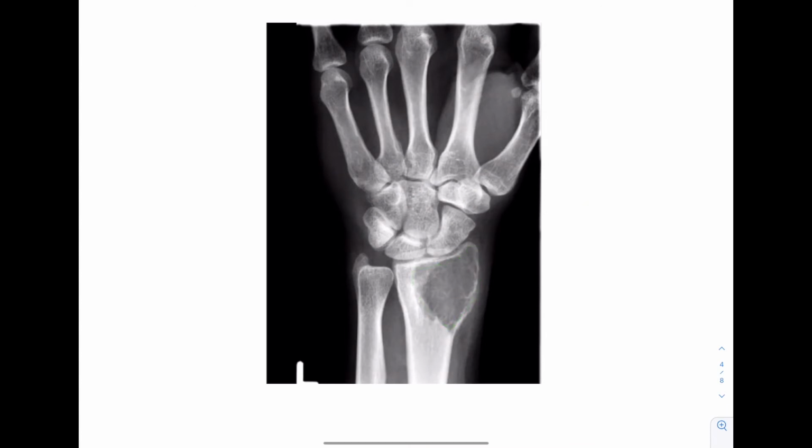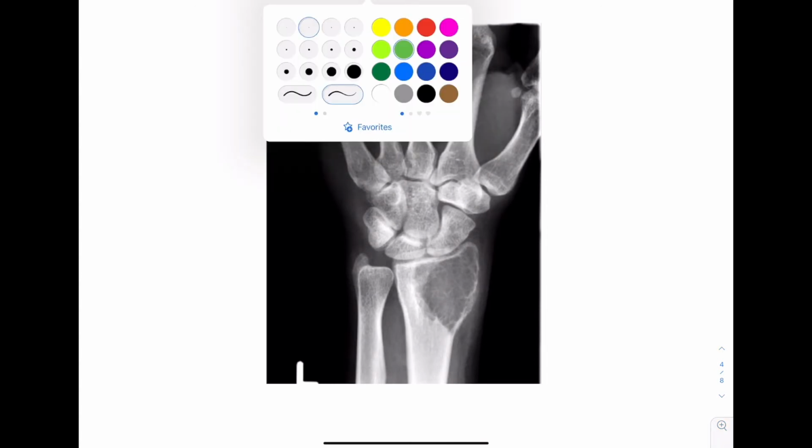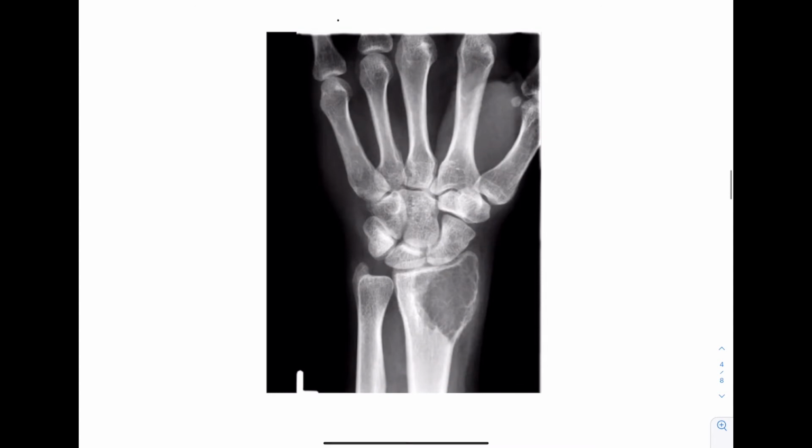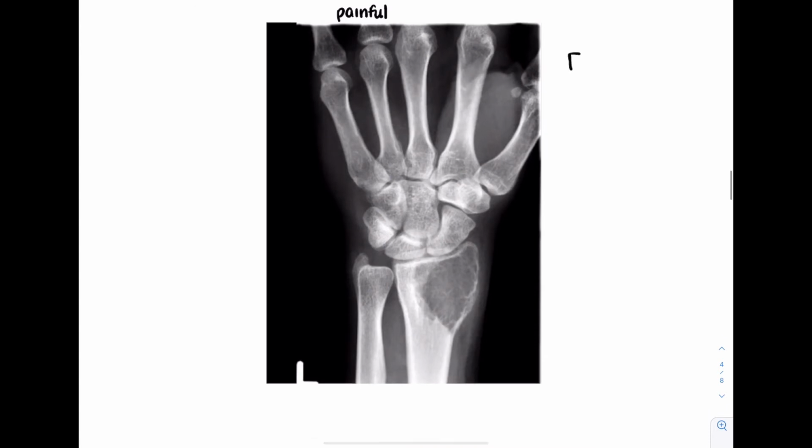But if I ask for a differential diagnosis, and we're going to do the Fegnomashic, so we're going to do the long way. Okay, so I was told that this is painful. I wasn't given an age. We'll just say no age. So painful.